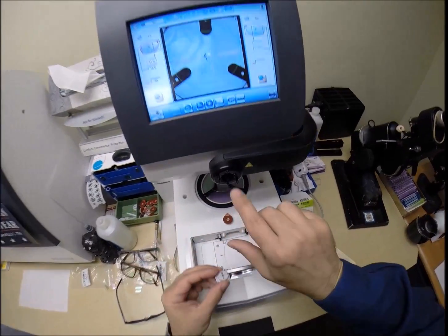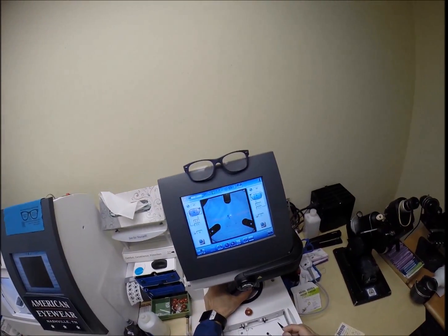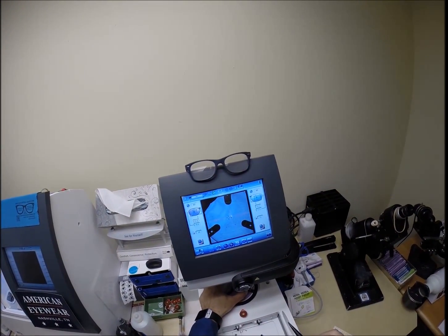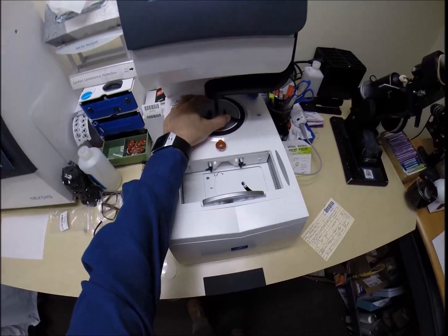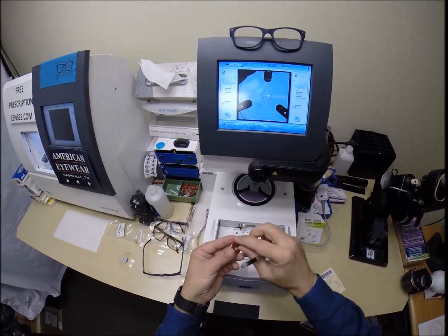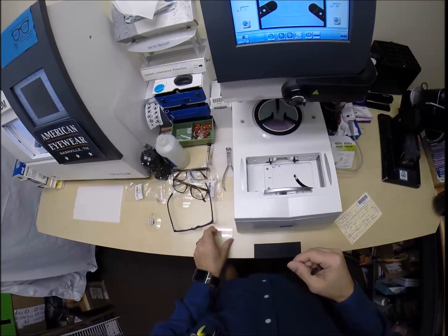The magnet is going to attach itself to something magnetical there in the arm, and that's what holds it in place. I'm going to place that black dot right there, which is right in front of the optical center of your lens. Hit that button, the arm's going to come down and place the block onto the right lens. We're going to do the same thing now for the unright lens. The lens that ain't right, just like me.